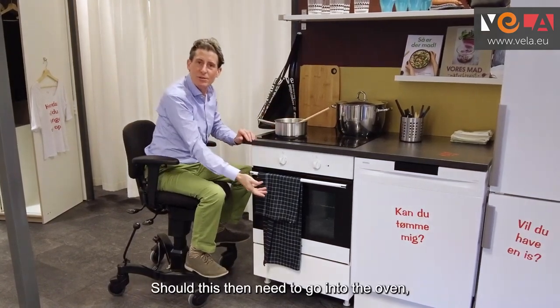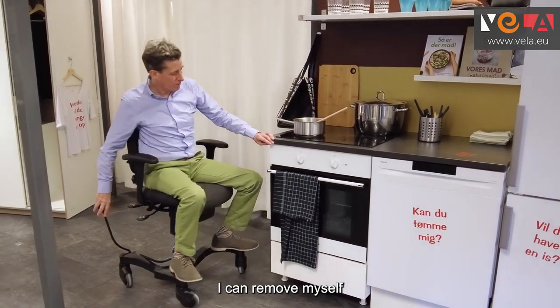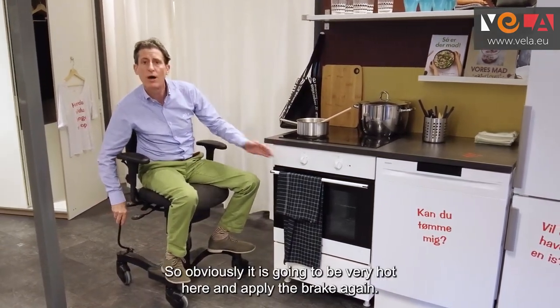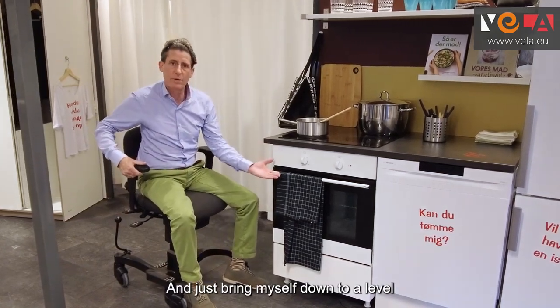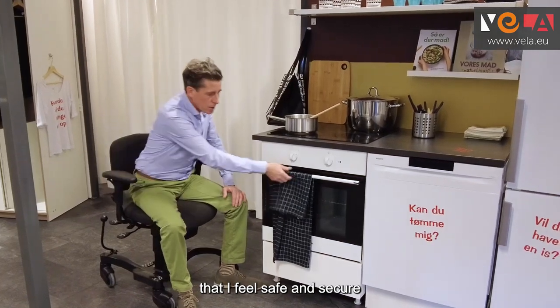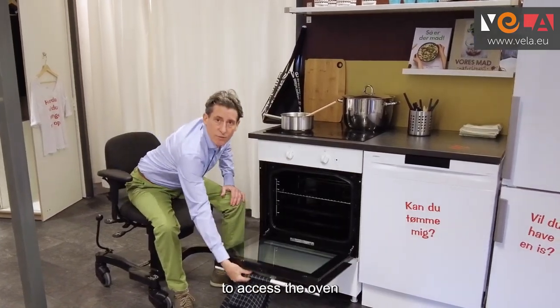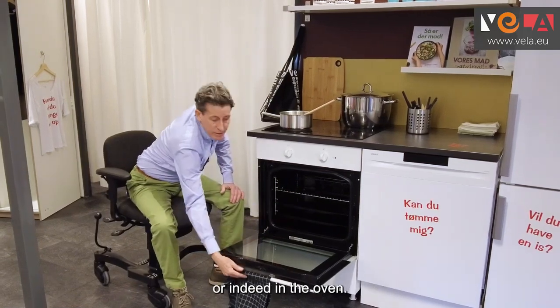Should this then need to go into the oven, I can move myself slightly back because obviously the oven is going to be very hot, apply the brake again, and bring myself down to a level that I feel safe and secure to access the oven, whereby I can pop things in the grill or indeed in the oven.